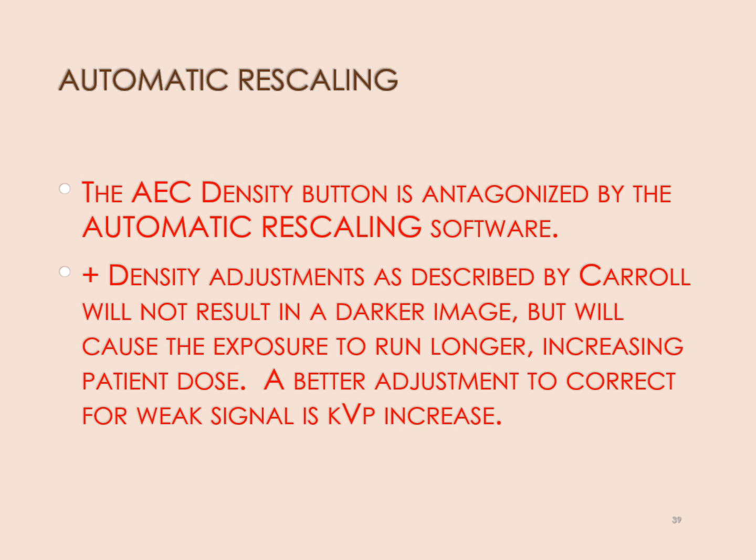So density adjustments, as described by Carol in the chapter about AEC, will not result in a darker image. And this is all my warning, because the AEC density button is antagonized by the automatic rescaling software. They work against each other.